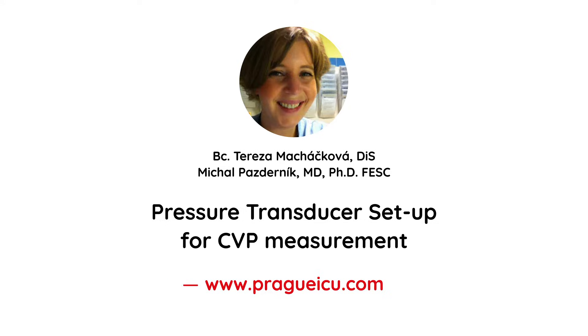Hi guys, welcome to Prague ICU. My name is Teresa and today we are going to show you how to set up a central venous transducer.